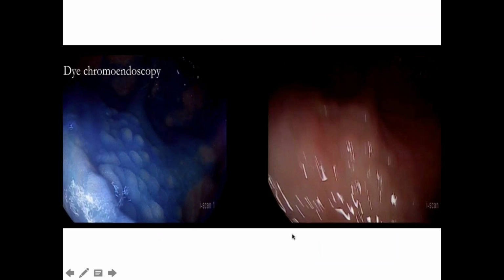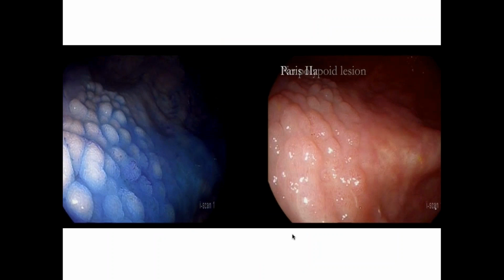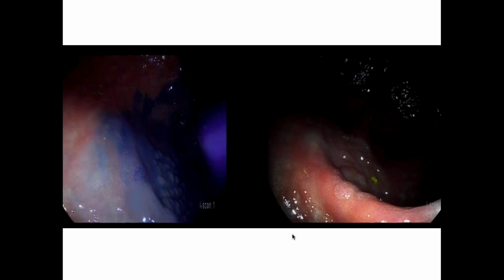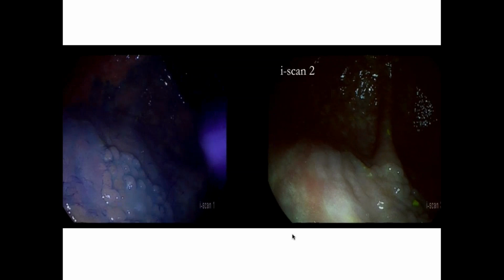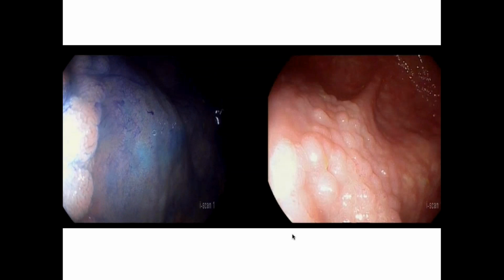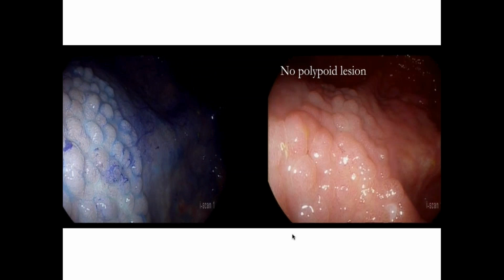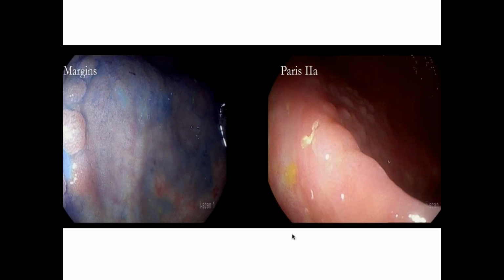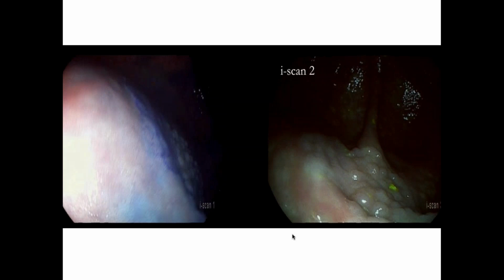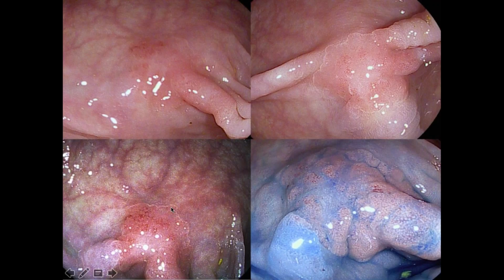So you have the same lesion. You are doing dye chromoendoscopy, you detect your lesion, you see this is a non-polypoid lesion, it's a Paris 2A, and then you will use also the other colorful hat. After your detection, you will wash, you will look with chromoendoscopy, and you will use all your toys, because all your toys give you the possibility to assess your vascular pattern, your margins, your mucosal pattern, and decide the best optimum strategy, endoscopic management versus colectomy. And now I'll give you some examples. So you can see here, barely visible in white light, the high definition defines much better your margins of the lesion. With virtual and dye chromoendoscopy, you can gain more endoscopic features.